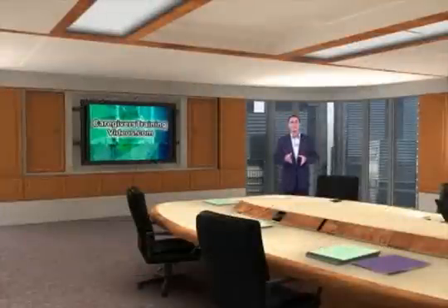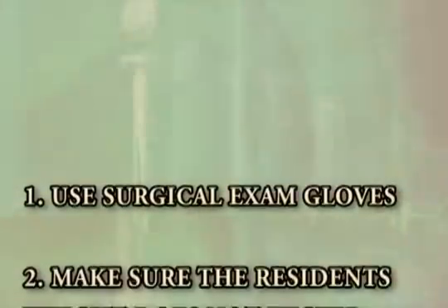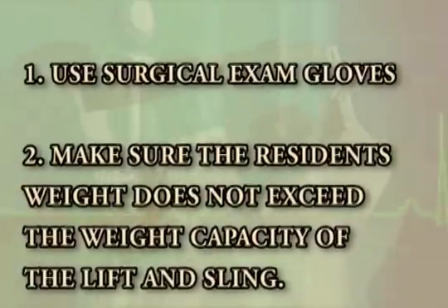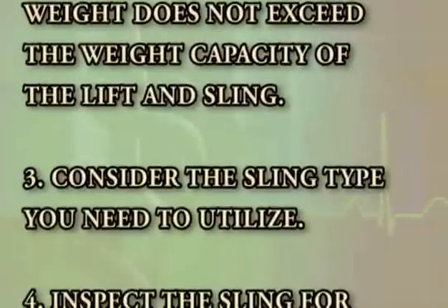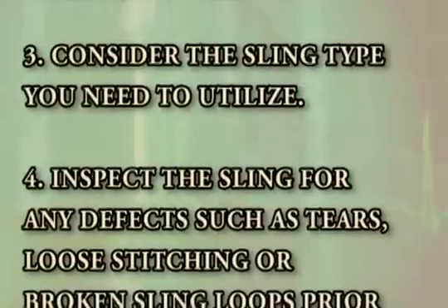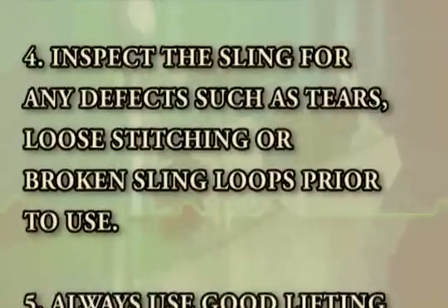You must take several precautions before using the lift. 1. Use surgical exam gloves. 2. Make sure the resident's weight does not exceed the weight capacity of the lift and sling. 3. Consider the sling type you need to utilize. 4. Inspect the sling for any defects such as tears, loose stitching, or broken sling loops prior to use.